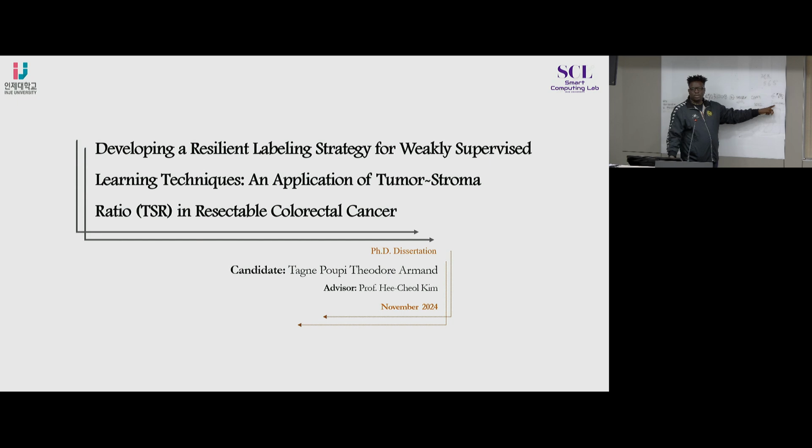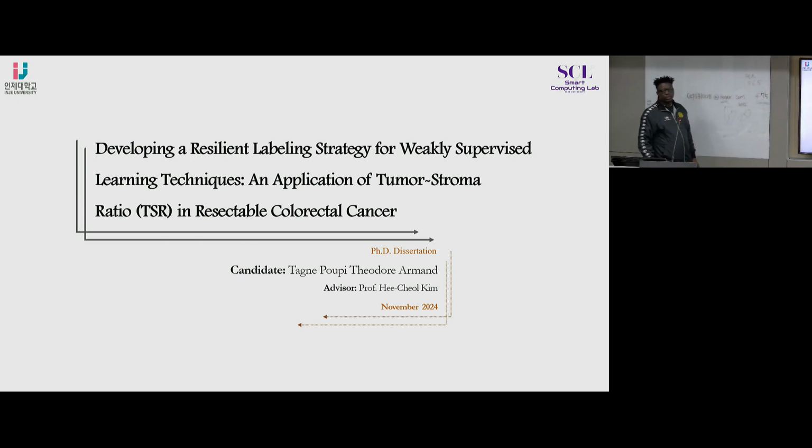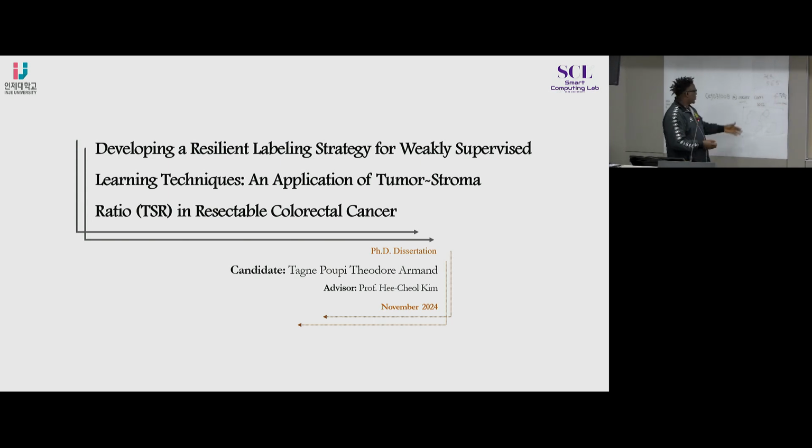No, it becomes wrong. So we need to really think about what is the exact slide level we need to assign here. The fact that the pathologist analyzes here and does not analyze the other parts is also a problem, because it may cause problems in the future. So we need to perform something to get the correct slide level before we proceed.